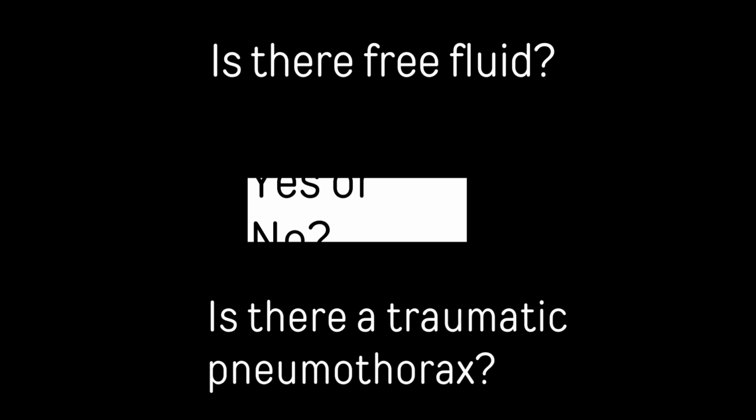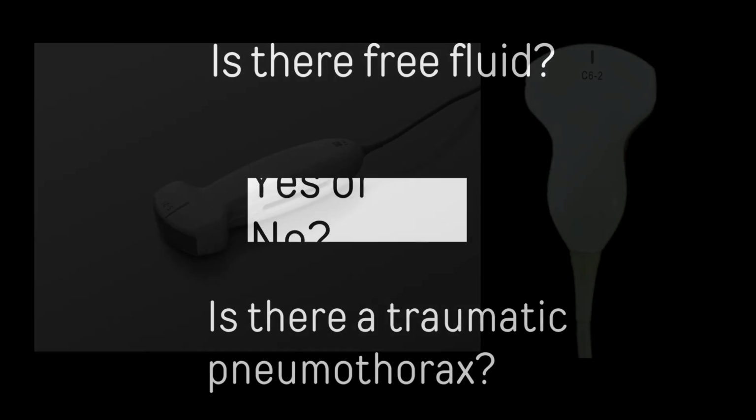Does that make sense? So you've got to put things in context, but it is difficult to quantify. Is this 500 mils, a liter and a half? We had an ectopic pregnancy the other day. If you put the probe there, it's in the right upper quadrant and everywhere. It's going to be a liter and a half, probably. But just keep in mind that it is really a binary question.